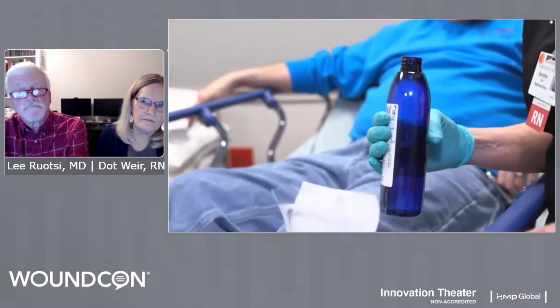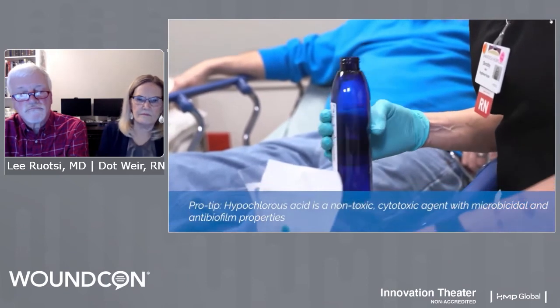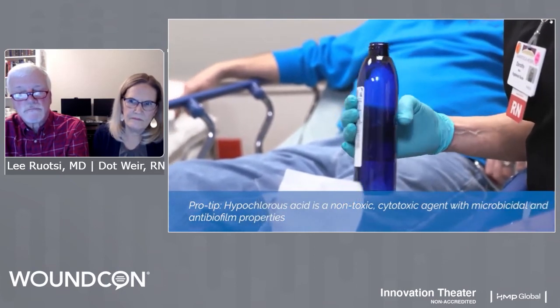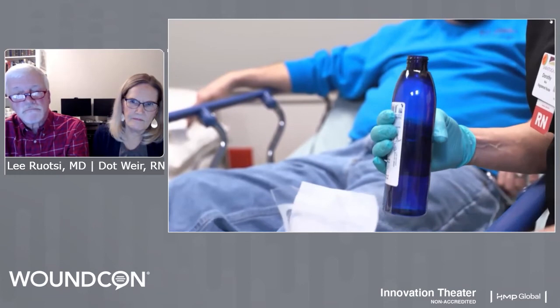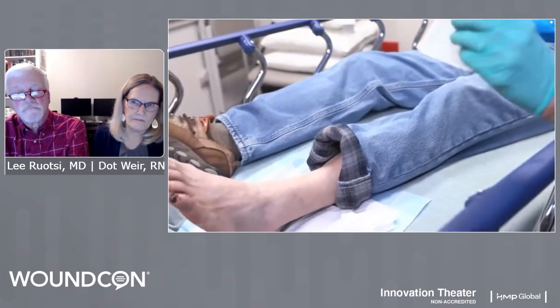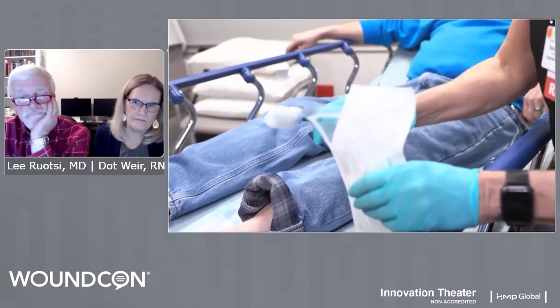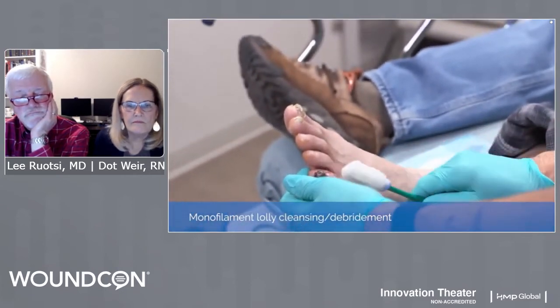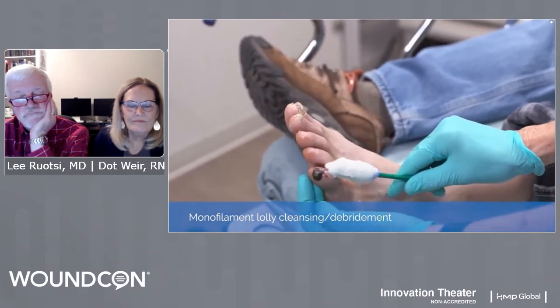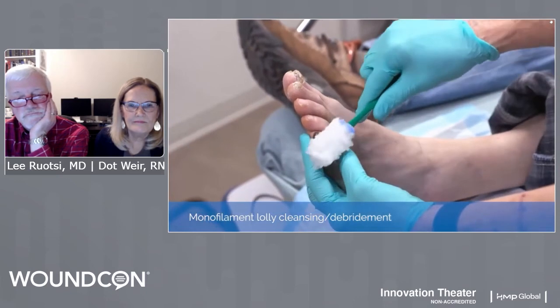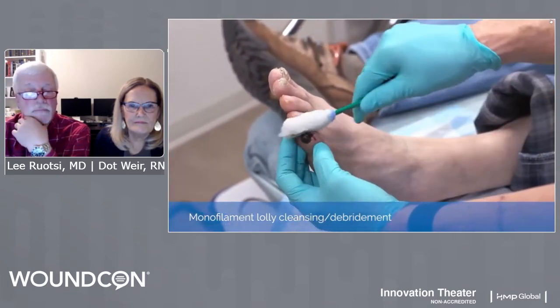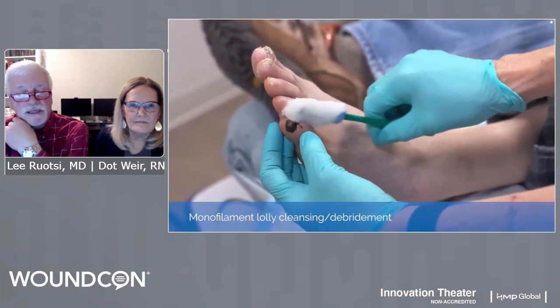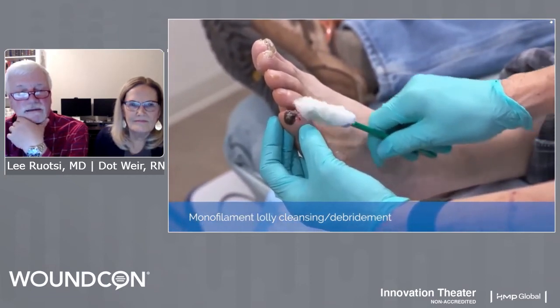Our standard cleanser in this clinic is hypochlorous acid, and we choose one that's pH balanced. We use no saline to clean here — I'm a stickler about wound hygiene and getting things off the surface of wounds safely. The Debersoft pads, when you put them under the fluorescence, turn really bright white — sometimes it's hard to even see what's on there. I would point out that the black spot that appears gangrenous is simply his toenail that has not yet decided to separate. I can still see some red fluorescing, and actually I'm seeing a little more — which means I've gotten some of the detritus off the surface and we're now exposing real tissue where the bacteria is being harbored. That leads us to say it's time to do a gentle debridement.